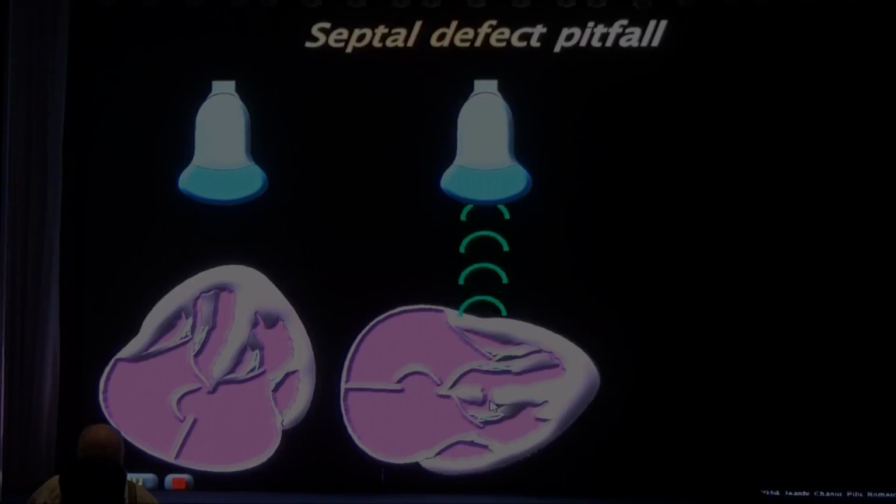You paid good money for that. You have to use it. You press on the button, color Doppler, and the color Doppler will have a double shift here, which is perfectly aligned with the septum, with a beam of ultrasound. You will have maximal Doppler shift, and you will have the best possible resolution for ventricular septal defect. Always do color Doppler on intercostal views of the septum to look for ventricular septal defect.